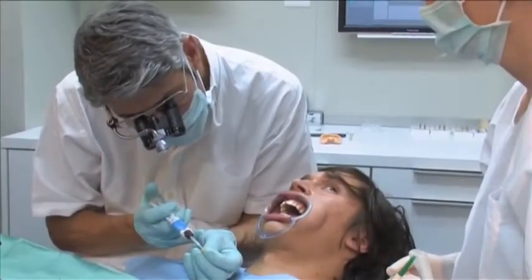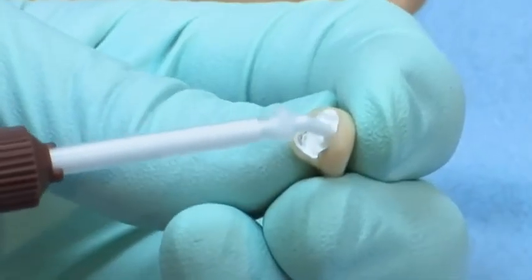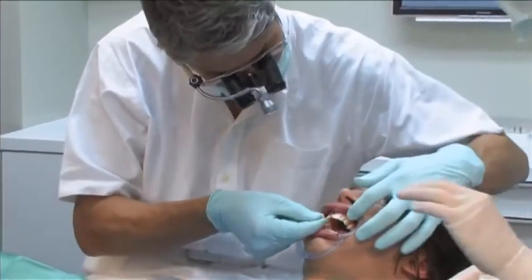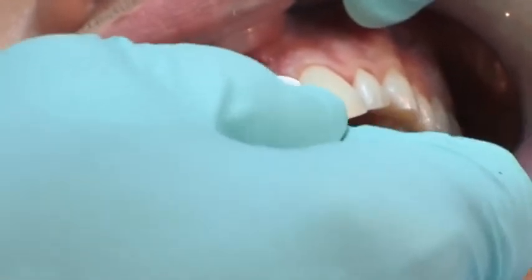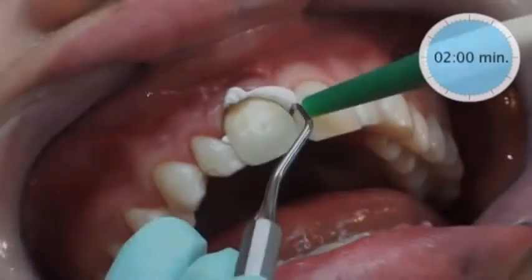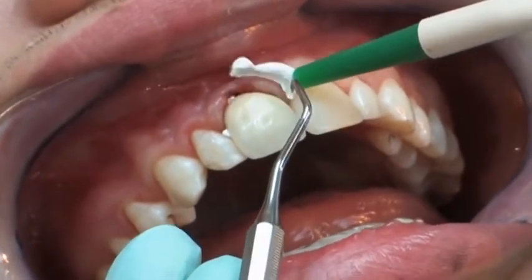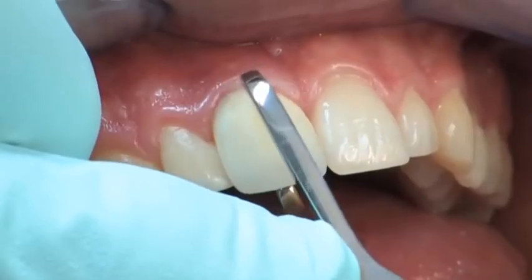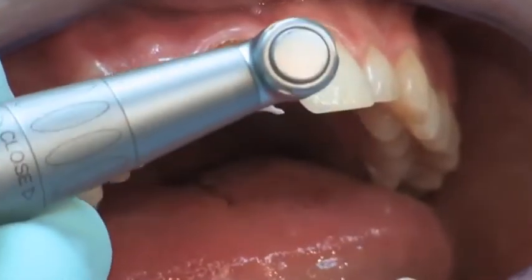The completed provisional crown is cemented using TempoSil2, a radiopaque temporary cement based on an addition reaction silicone. After a short setting time, excess material is removed. The provisional crown is carefully removed and the preparation is cleaned using a fluoride-free cleaning paste.